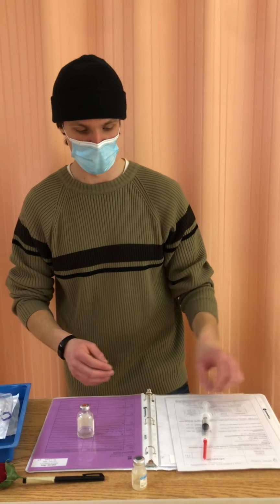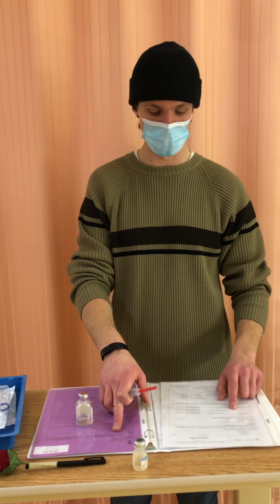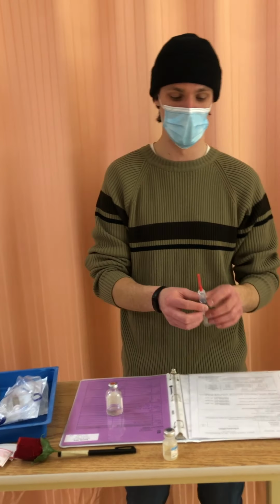So now I can go ahead and draw out the amount of medication I need. So I just reconstituted for 2 grams, which is in here. I only need 1 gram according to my MAR. The final volume of 2 gram reconstituted is 8 milliliters. I need half of that, so I'll draw out 4 milliliters of medication to reach 1 gram.